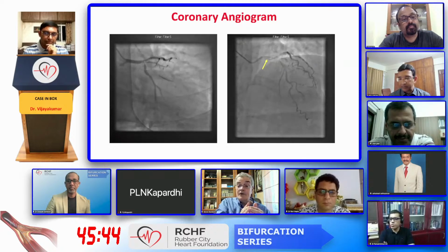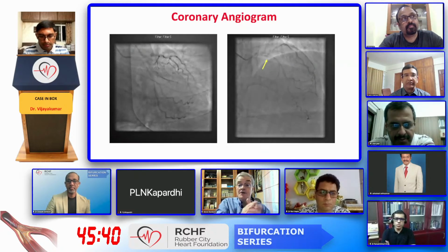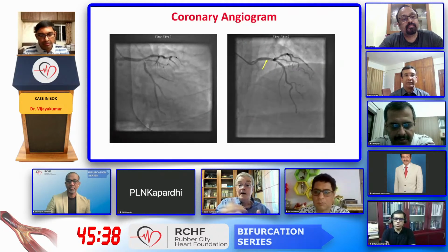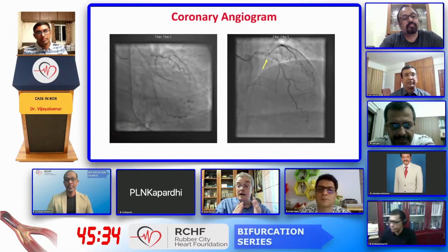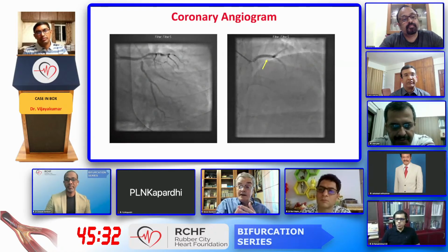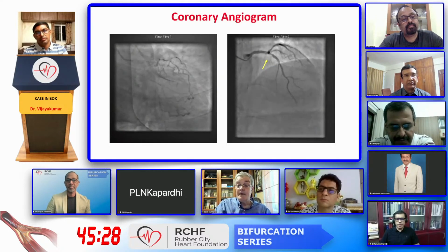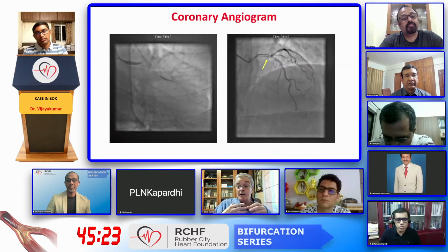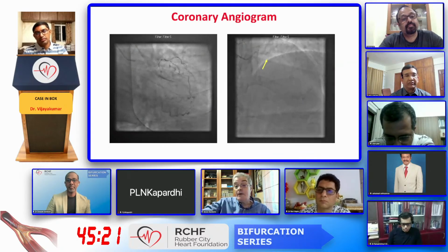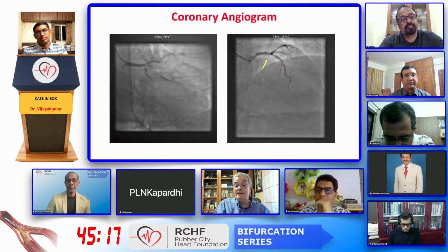If we are able to cross a distal cell and partially scaffold the ostium of the LAD, then we may discuss between T-TAP and culotte. If the cell is not distal, but central or proximal, there is already some metallic neocarina, so we need to go for TAP or culotte. In my case, I will wait for the decision on the second stent until we need the second stent.